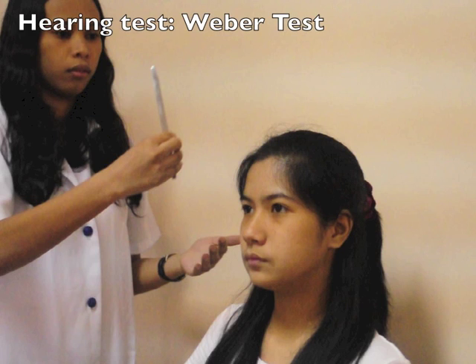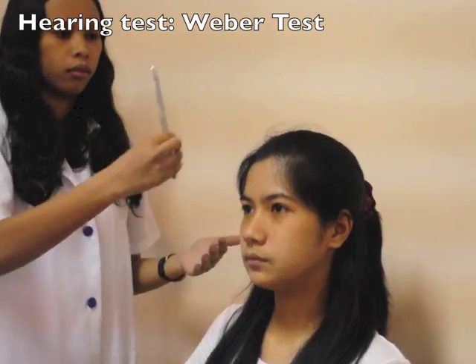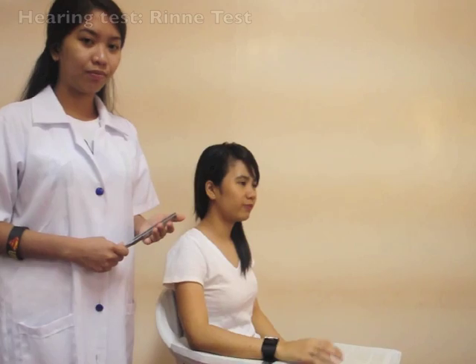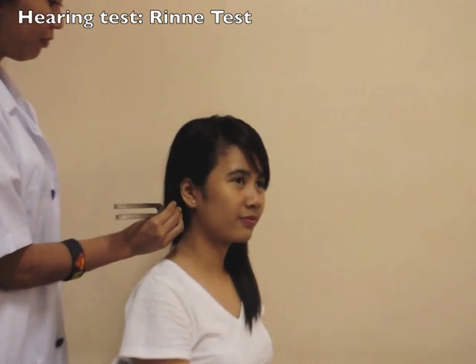Hold the tuning fork by the stem. Tap the tuning fork prongs on the palm of your hand. Place the vibrating tuning fork in the middle of the patient's forehead. Note lateralization of sound. Place the vibrating tuning fork on the mastoid process.